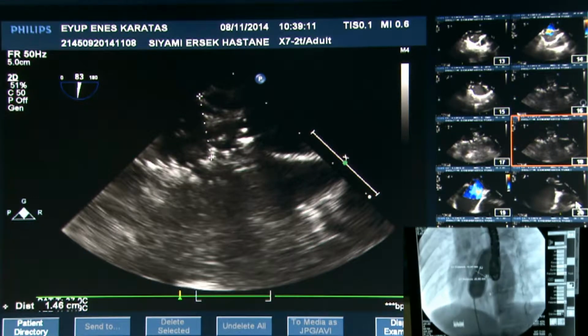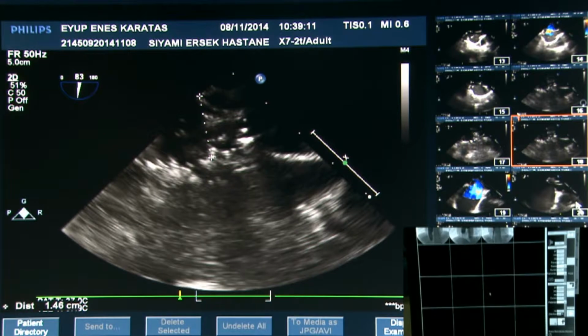But it's only subjective. It's the very floppy rim, not slightly floppy rims. We will explain during coffee break the difference between floppy and very floppy.